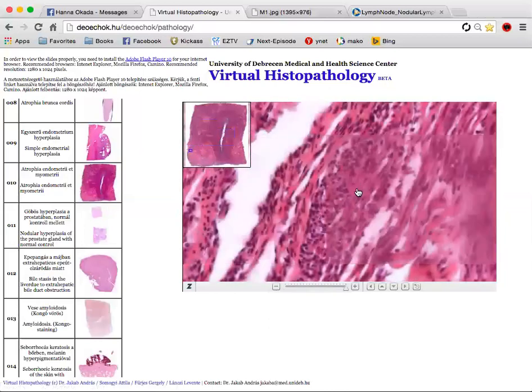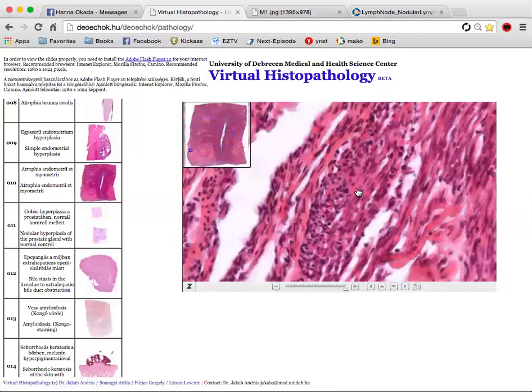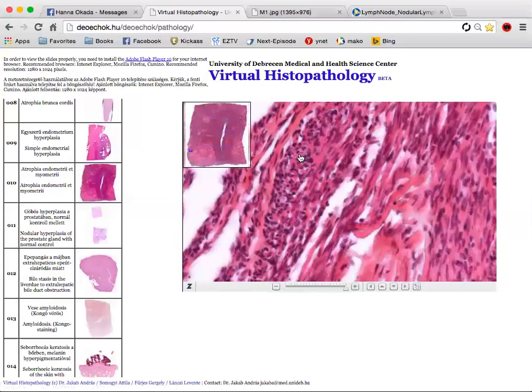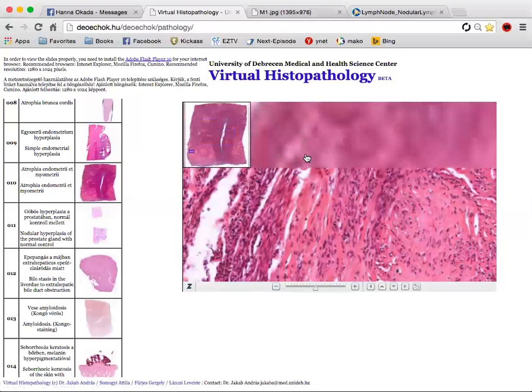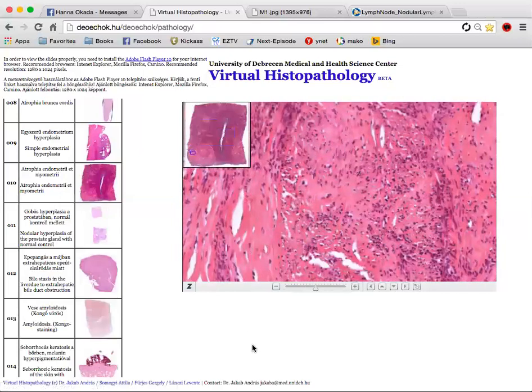It's atrophied because it got pushed, and there's not enough blood supply because it got pushed. It doesn't have room to grow. Wait, so this leiomyoma pushes the normal tissue and the normal tissue will shrink, I mean undergo atrophy? Yeah, you got it. Compressional atrophy, that's the term.